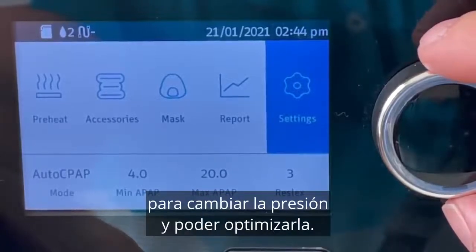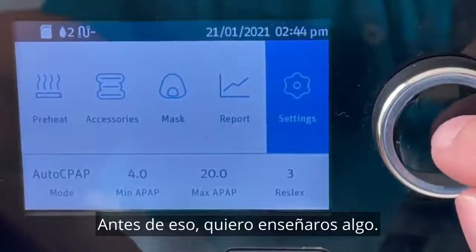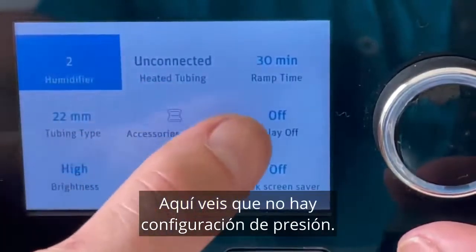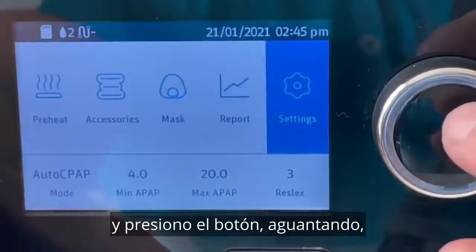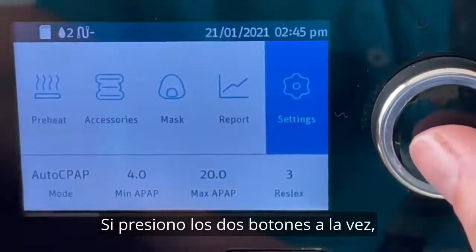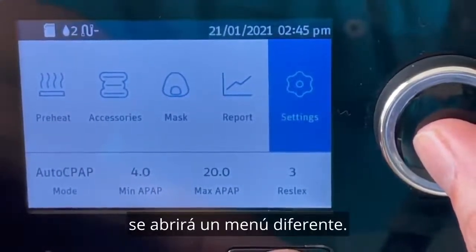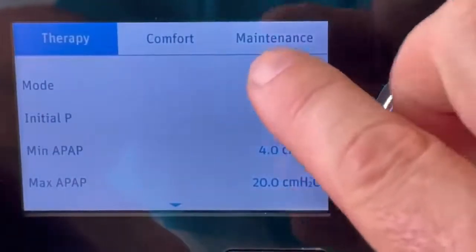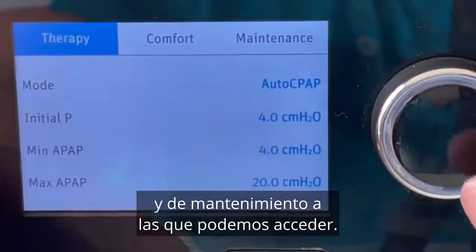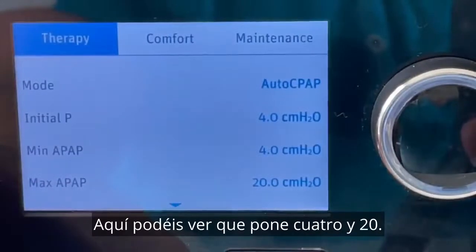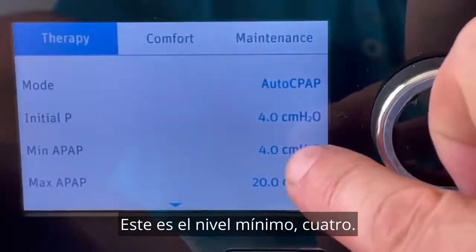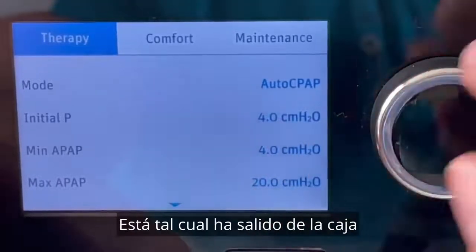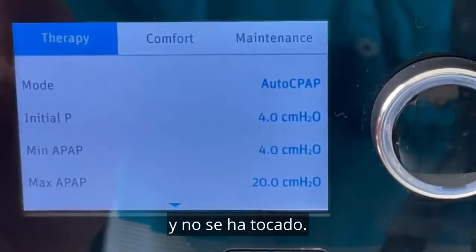Now we're going to go into the settings to change our pressure settings. If I click this click wheel and go to Settings, this is the basic menu — you can see there are no actual pressure settings here. But if I go back out and hold this button down along with the home button simultaneously, it opens up a different menu — that's the clinical menu. Now we have access to all these pressure levels, plus comfort and maintenance features.